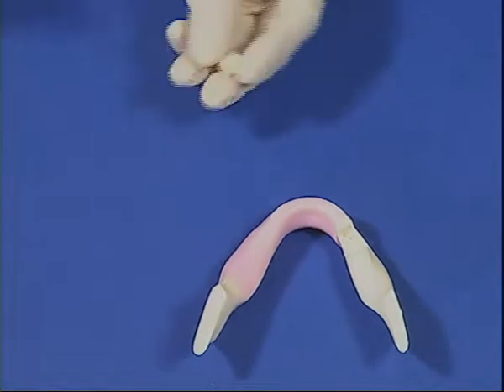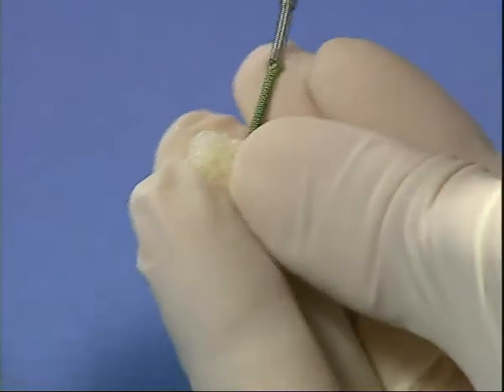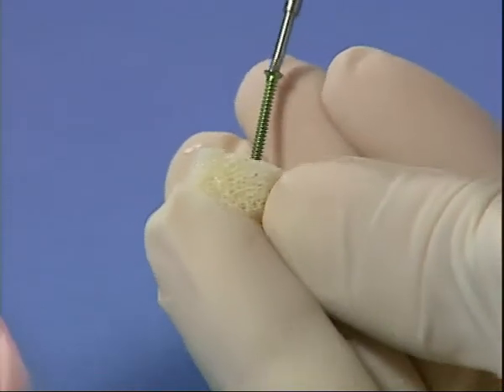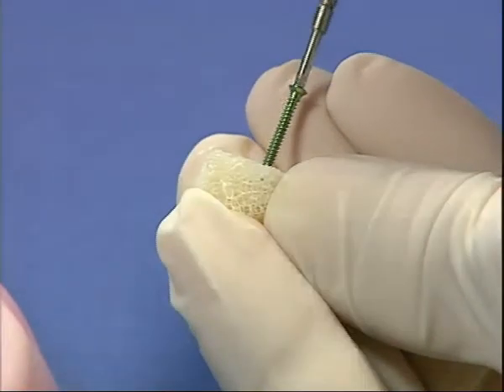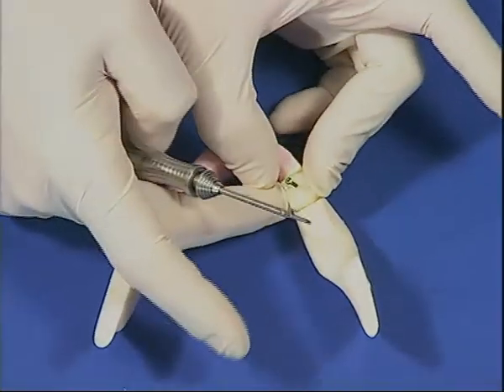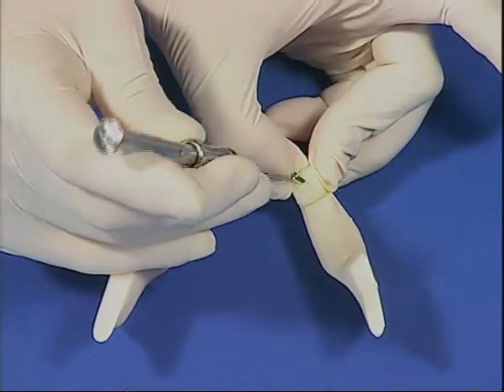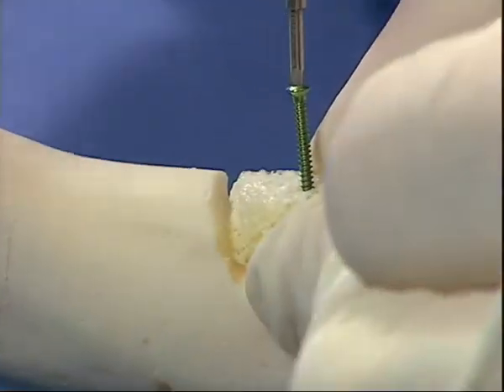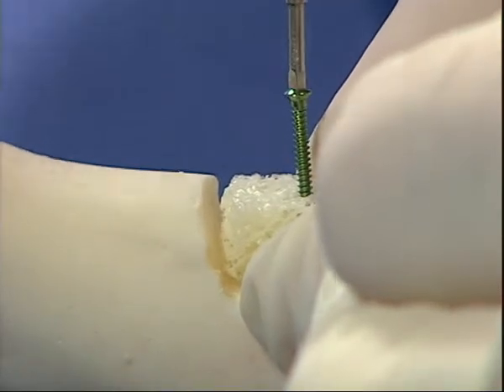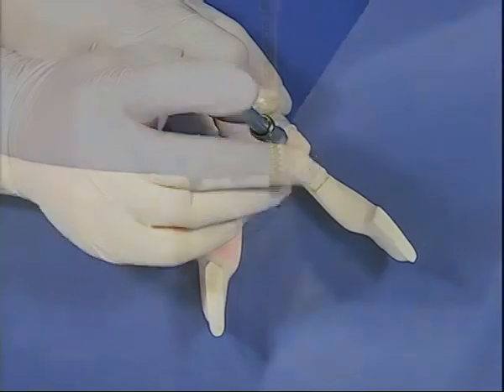To model the block, you can use normal cutting tools, such as a surgical knife, in order to neatly cut and collect the leftover pieces that will be used further on. You can also use drills and trephines. Even though this material is tough, it is also elastic so as to be easily modeled to meet particular requirements. This method is really very simple and is used in the case of large bone defects where the granular form makes the reconstruction quite difficult.